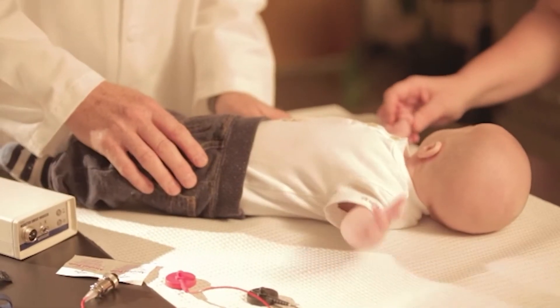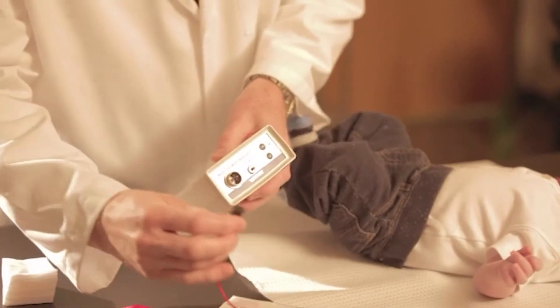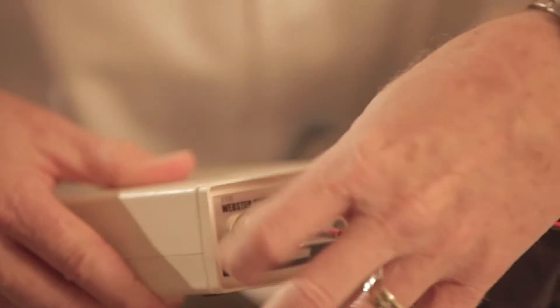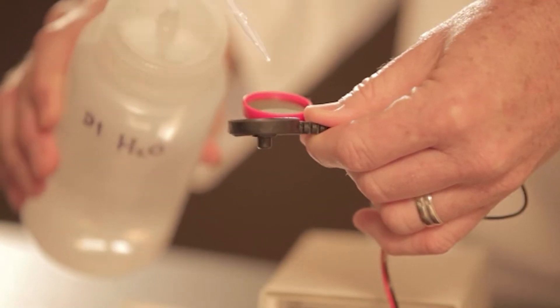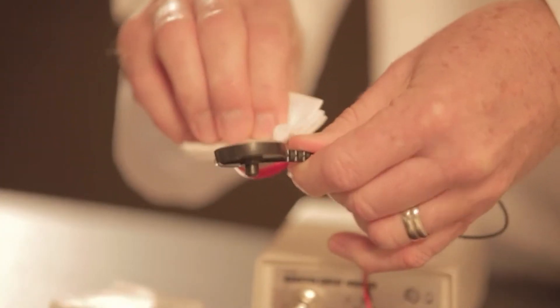Make sure that the groove on the plug matches up with the inducer. Connect the electrode plug to the sweat inducer and tighten the lock ring to secure the connection. Clean the electrodes with deionized water and wipe them dry with lint-free tissues or gauze before each use.